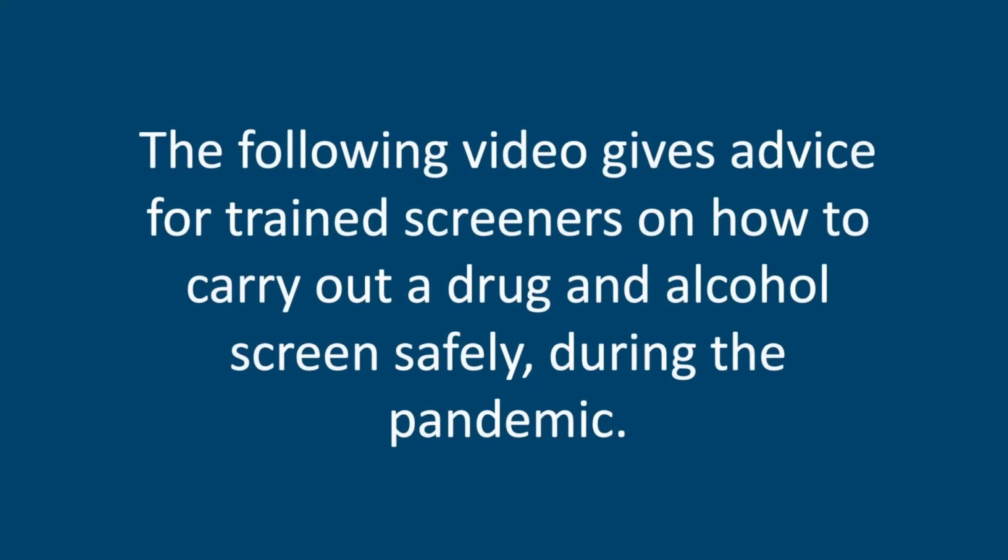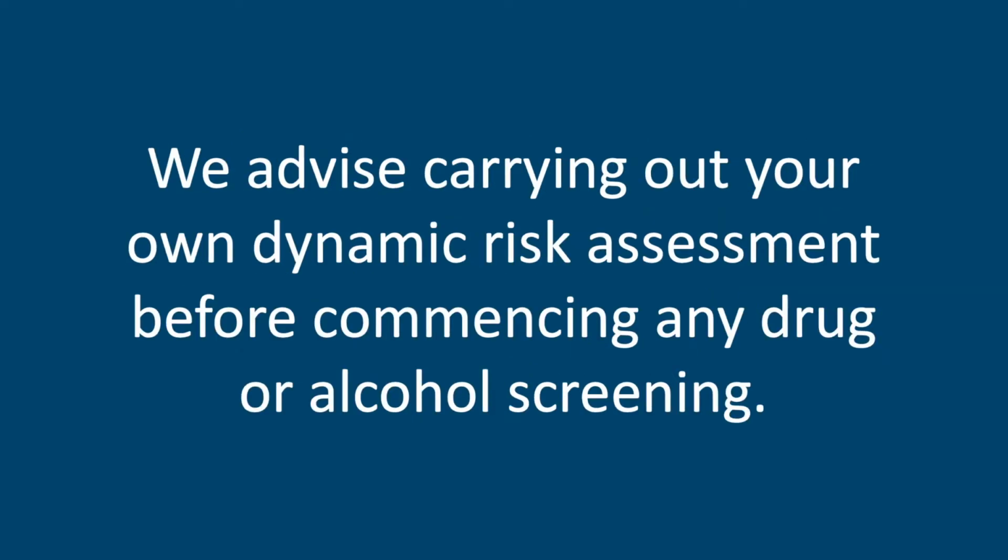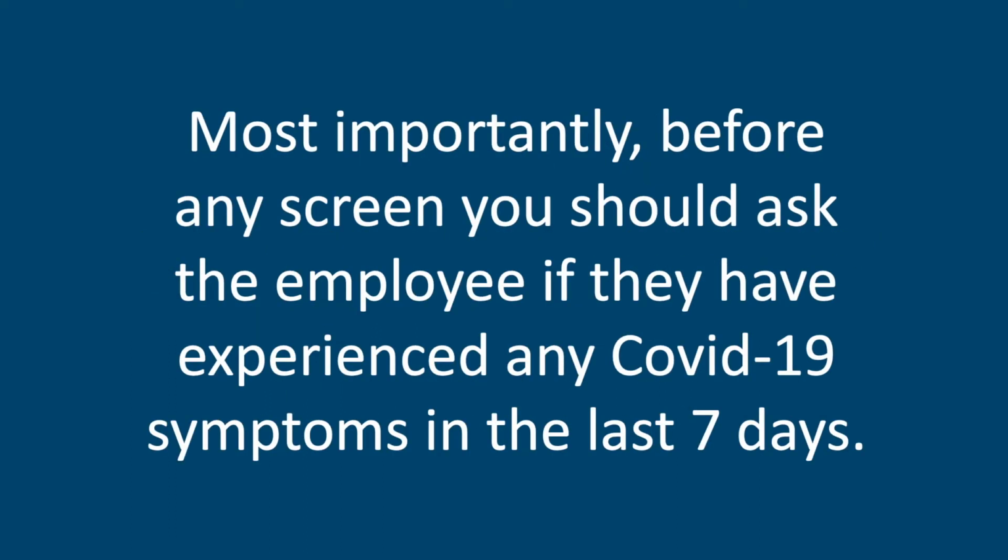The following video gives advice for trained screeners on how to carry out a drug and alcohol screen safely during the pandemic. We advise carrying out your own dynamic risk assessment before commencing any drug or alcohol screening. Most importantly, before any screen, you should ask the employee if they have experienced any COVID-19 symptoms in the last 7 days.